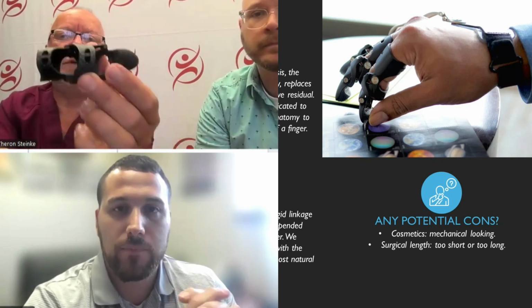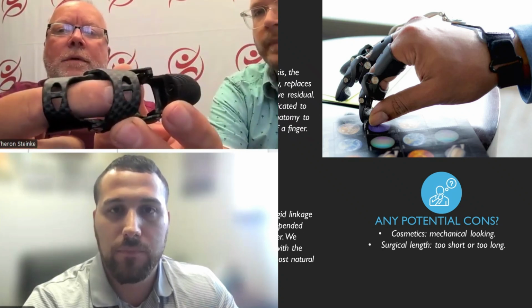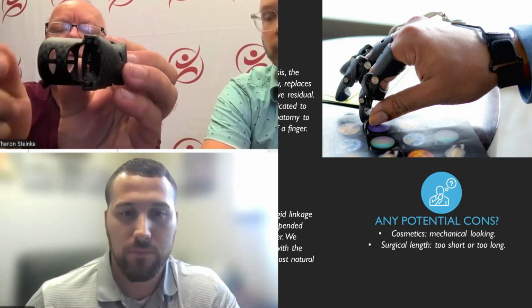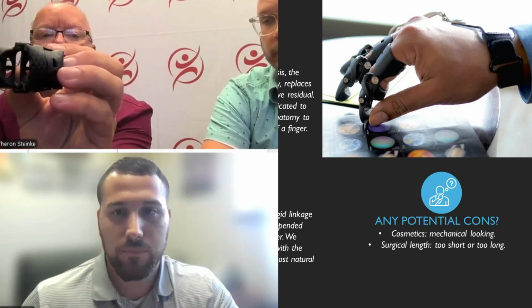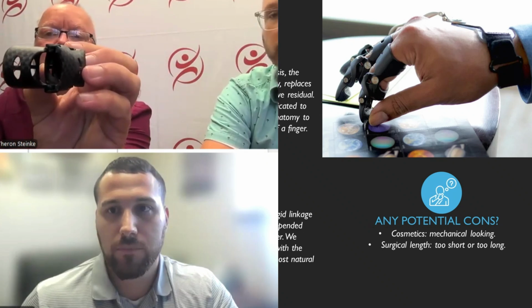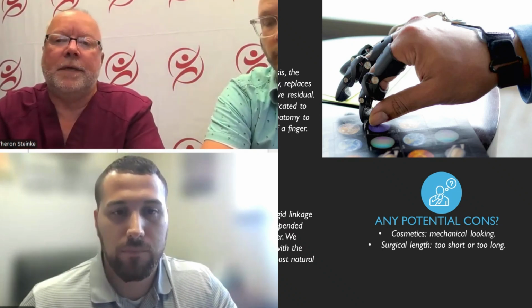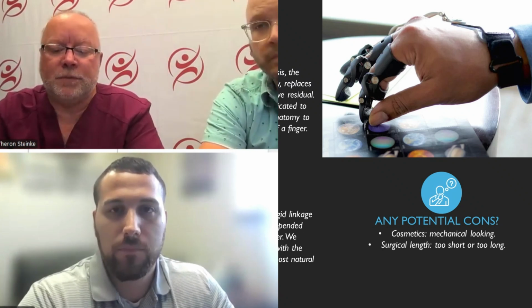Well, we'll just show you for this. If you can see, there's a set of holes inside this, and then I believe on that side too. These slots right here are for the rubber shims that we would put in there. The rubber shims come in different thicknesses and they just pop inside there. So if the device fit well the day of delivery and 4 months later it was a little bit looser, then we can put a shim inside there to tighten it up to make it function properly.